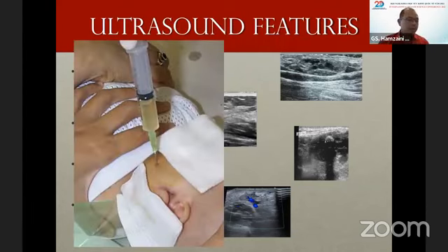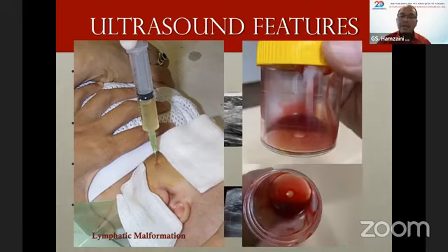Okay, so how do we differentiate this lesion from lymphatic malformation? As you can see, the lymphatic malformation has cystic aspirate. If you puncture the lymphatic malformation versus the venous malformation, what you'll get in the venous malformation is venous blood. So this is a lymphatic malformation. This is a venous malformation.